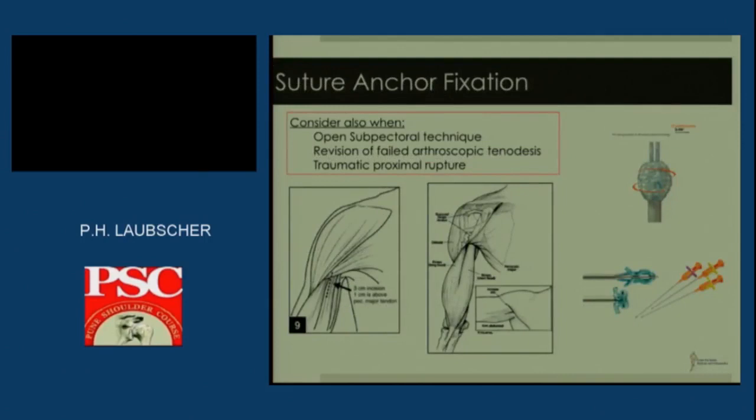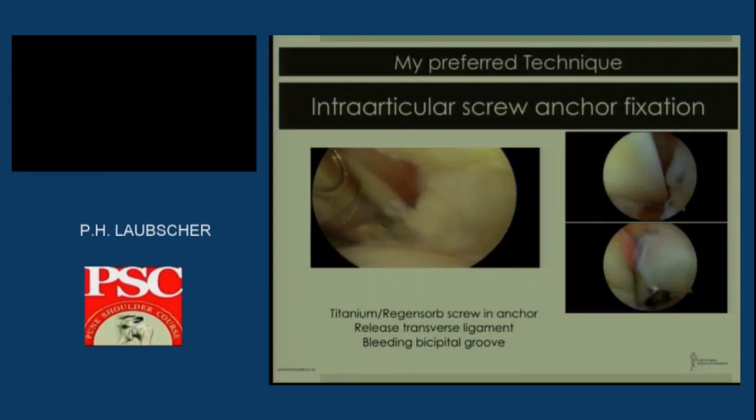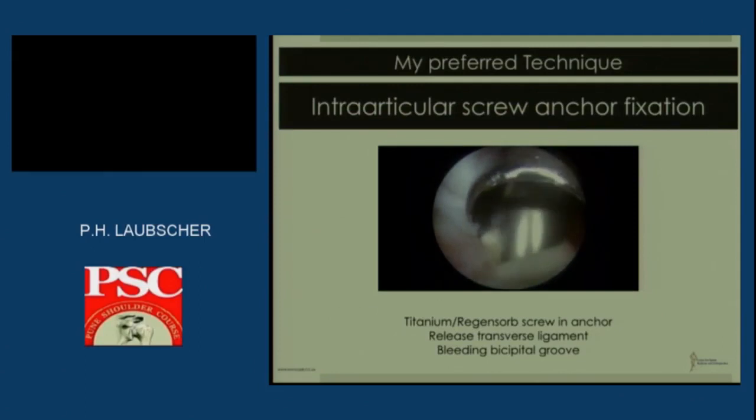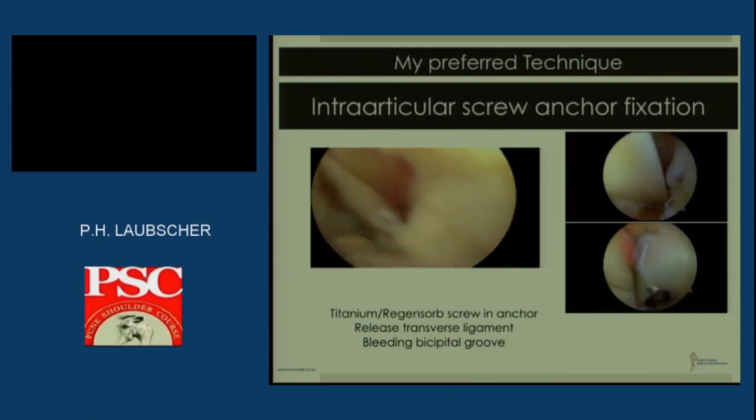Looking at the suture anchor fixation, I think it's important to remember that we have cortical bone on the proximal humerus. So as soon as you go with a big 5 mm interference screw in this area, you have a risk of fracture. So if I consider this in a revision case or in an open case, then I will use a suture anchor. So in looking at the technique that I use, I just want to play this video. Sorry. Let's return. Is it possible to play that video for me?